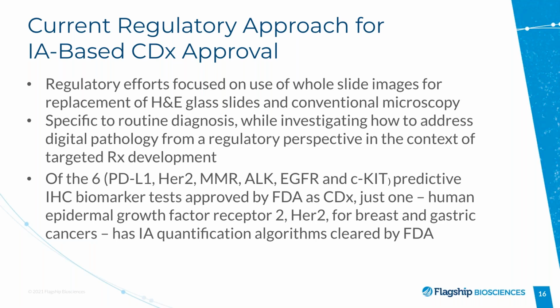rapid drug development and bringing to the market a larger number of targeted medicines in oncology and in any other therapeutic area. So far, we do not have solely image analysis cleared as a companion diagnostic by FDA, but there are in vitro diagnostic tests with image analysis quantification algorithms embedded. They're cleared by FDA, and the slide lists some of them.